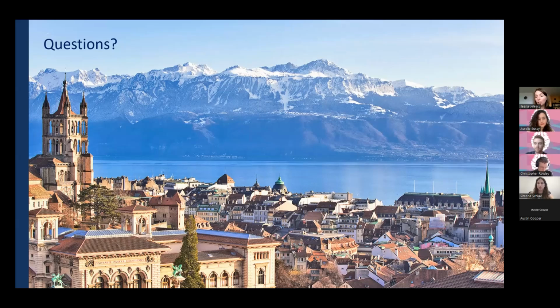Yes, thank you for the question. Yes, definitely. So NODDI is also a derivation of the standard model that assumes impermeable compartments. And definitely in gray matter, it's not the case, especially if you don't control the diffusion time that you're acquiring data at the scanner. Likely, it's usually relatively long diffusion time, definitely longer than 20 milliseconds. So this will definitely bias your estimates. And so SANDI for gray matter is definitely a better version than NODDI because at least it also accounts for cell bodies.